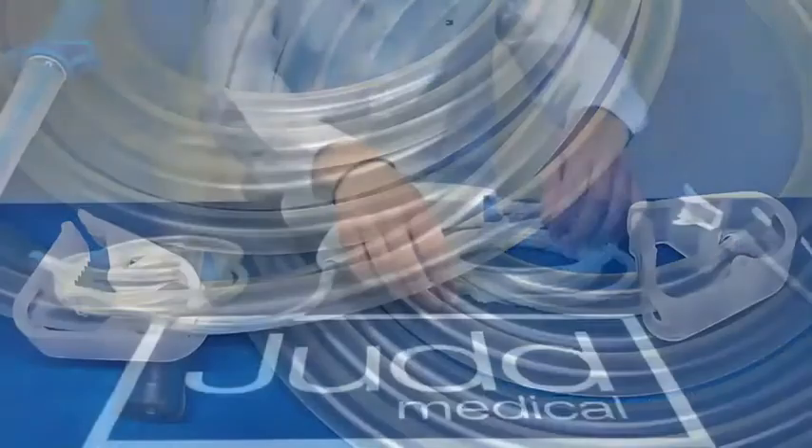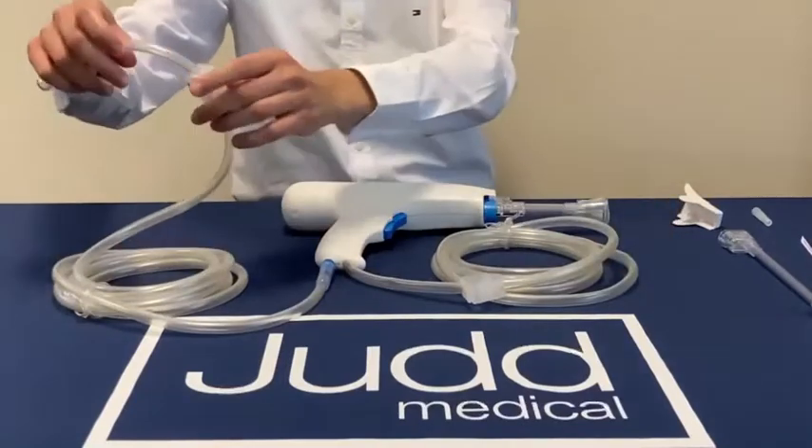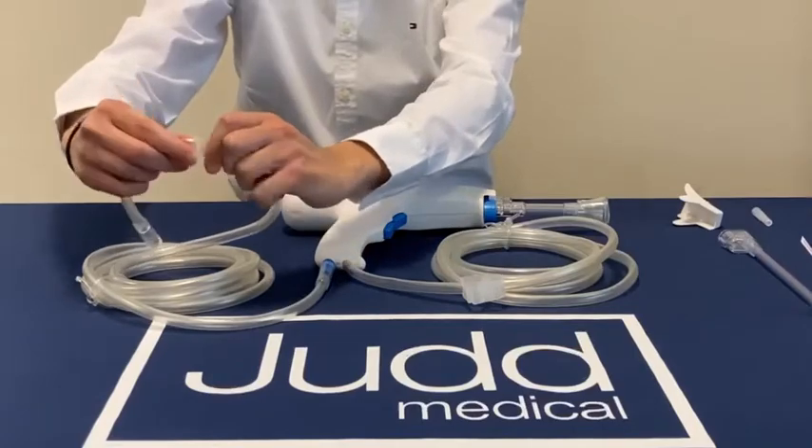The device also incorporates a clamp on both the irrigation line and the suction line, which can be used in the event of leakage of any irrigation fluid and are totally adjustable.